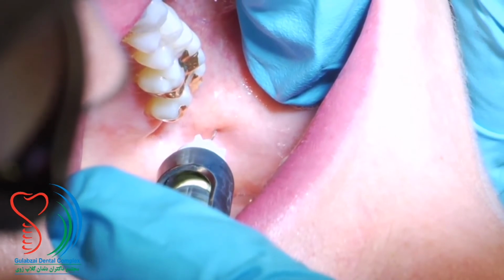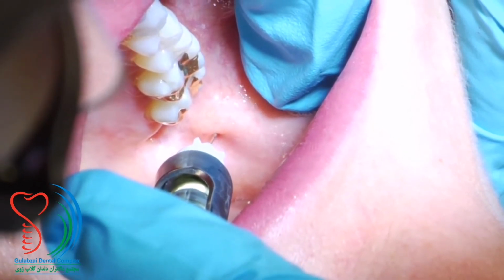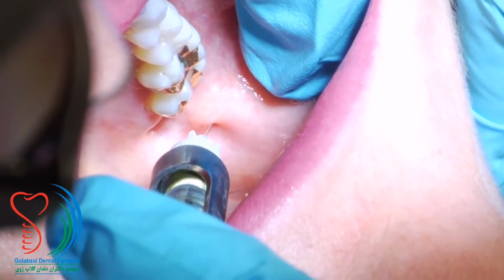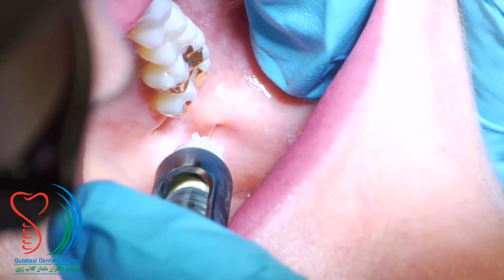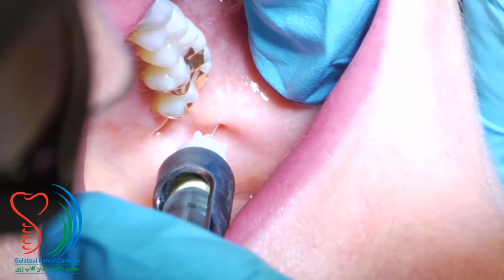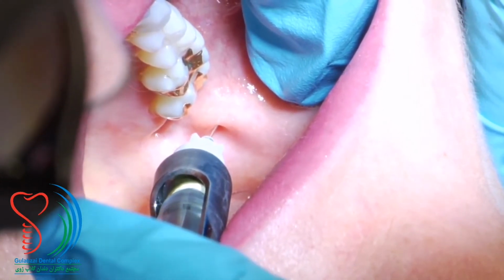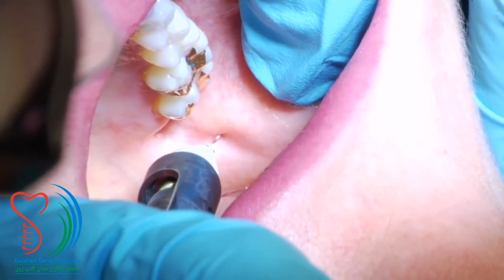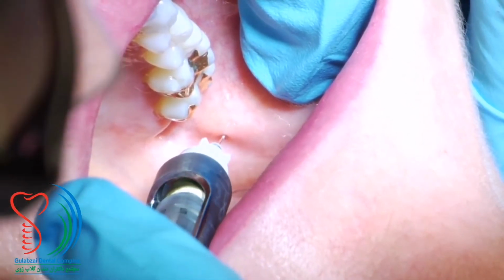Once you've contacted the ramus, you must back off 1 millimeter before you aspirate and deposit, so that the needle is not tightly against the periosteum. Obtain negative aspirations in 2 planes and start depositing about 3/4 of a cartridge of anesthetic with multiple aspirations.